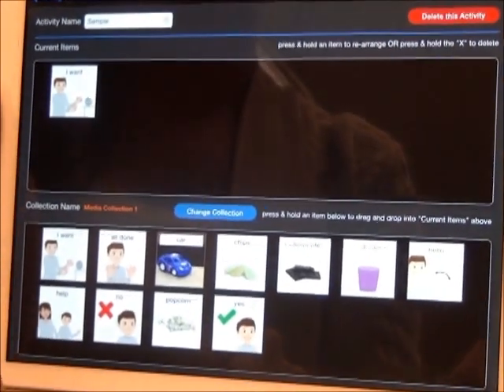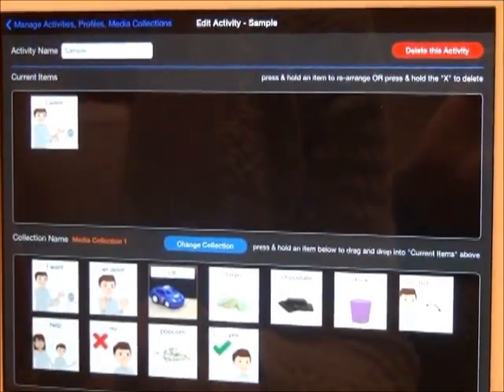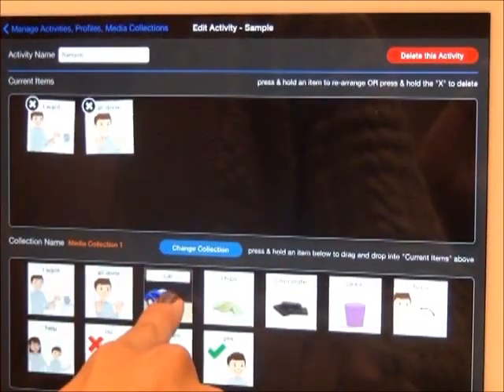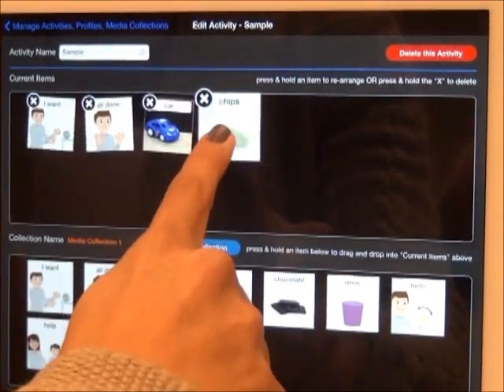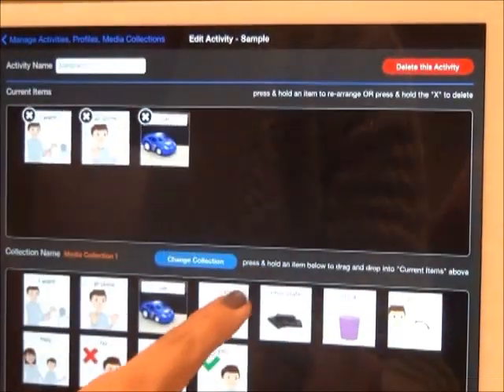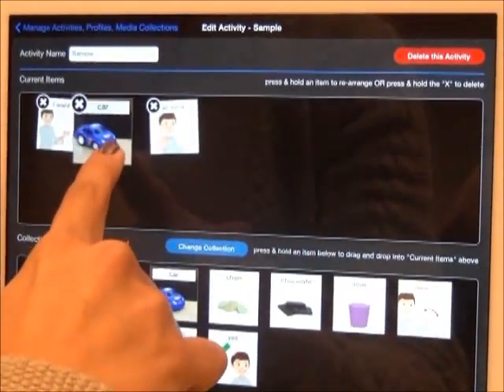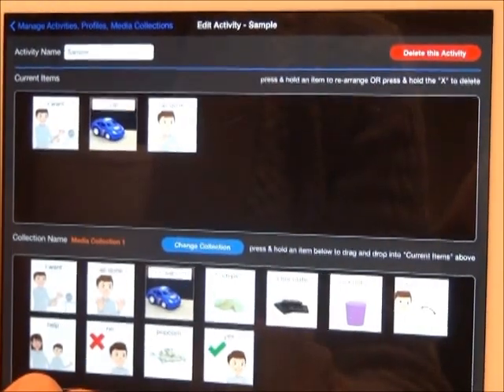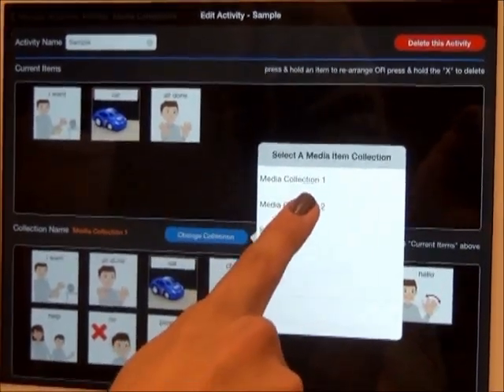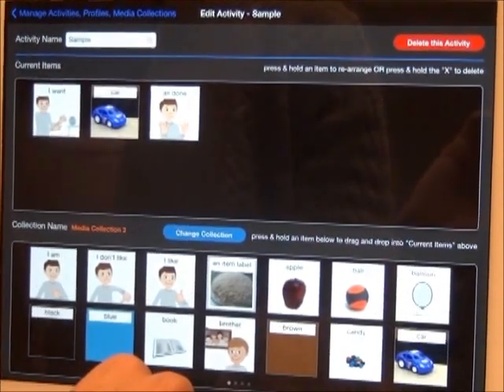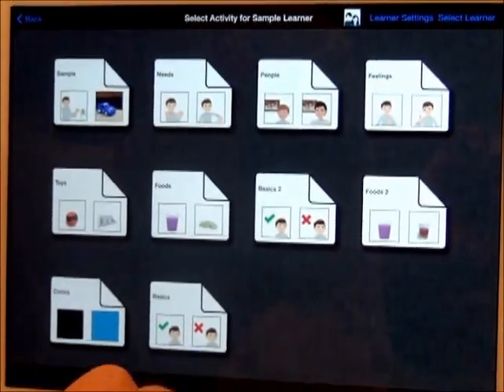The screen is split into two parts. Current Items shows which media items are already in the activity sheet. Collection Name shows the contents of a media collection. To add a media item, select and drag it into Current Items. To delete an item, press and hold on the symbol and hit X, then select Yes. You may also reorder items by pressing and holding, then dragging. You may also change the media collection for more symbol options by selecting Change Collection and choosing the collection you desire. Once finished, return to the home page and hit Play to enter play mode. Select an activity sheet and start communicating.